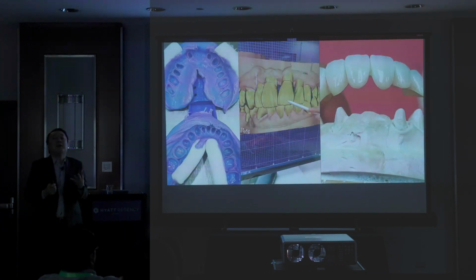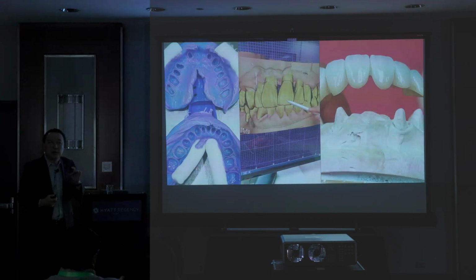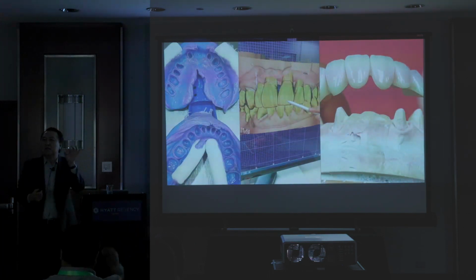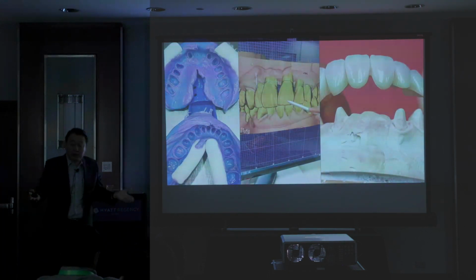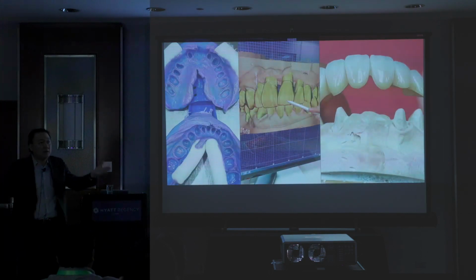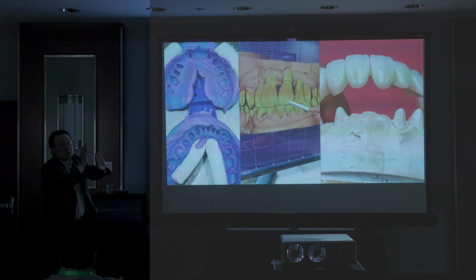in the denture setup, whenever they bite, the bite is not accurate. Sometimes it pops out, sometimes it's inward or outward. So I like the PMMA provisional from digital, whatever, print, whatever. The problem is, whenever you make the PMMA, it's not a one-time shot. Midline is off, canted, size difference. How can you change it? Okay, another printing then. That's fine. That's another option. Anyway, whatever they set up, the printed prototype, we have to follow that, right?